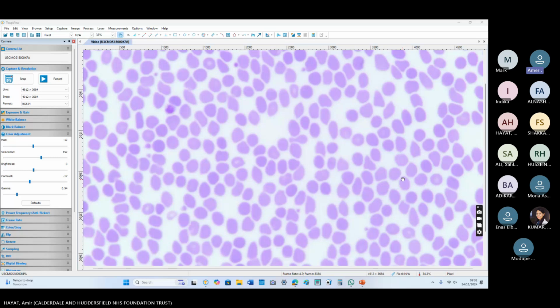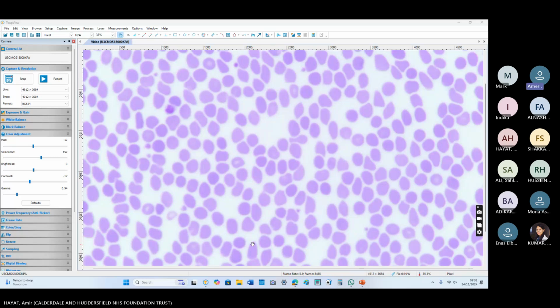The ruler, these are attached to one another. One is not attached. If you can see these red blood cells, they have made different shapes according to the neighboring RBC. They look like compressed to one another. This is not a regular RBC shape. This is made because they are too much and they are trying to adjust themselves here.